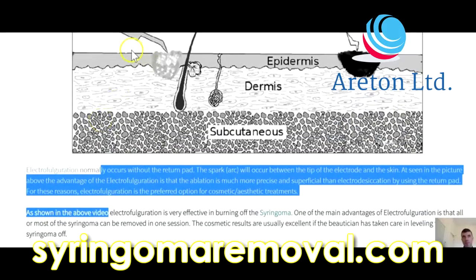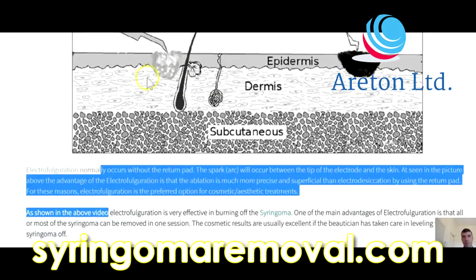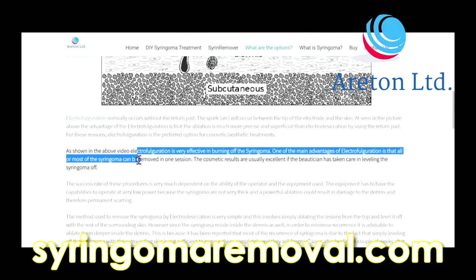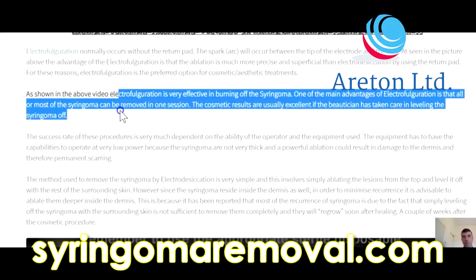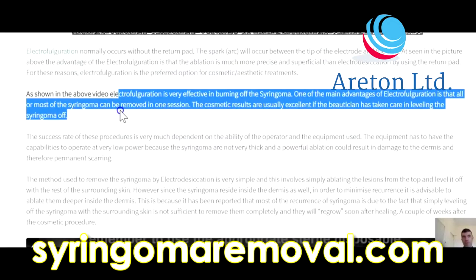If you look at this picture, electrofulguration is doing more of a superficial treatment, whereas electrodesiccation goes more inside the skin. As shown in the above video, electrofulguration is very effective in the treatment of syringoma. One of the main advantages is that most of the syringoma can be removed in one session.